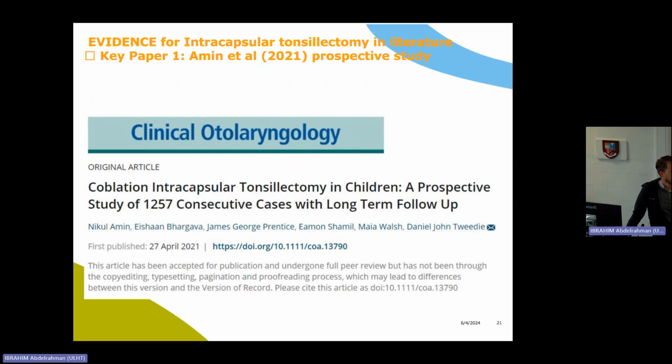and we have a paper that was put out to say that there's no airborne particles or risk of any airborne materials, as much as we could test, that come from the plasma when you're doing the papillomas or tonsils. It was something that was raised around the time of COVID because of the airborne stuff and the need for masks, but everyone was just super cautious and wore the masks anyway.